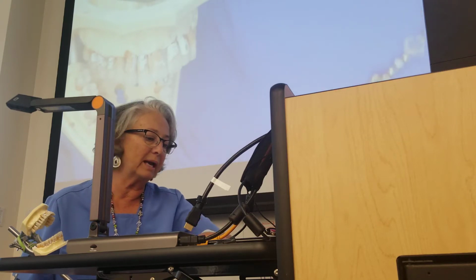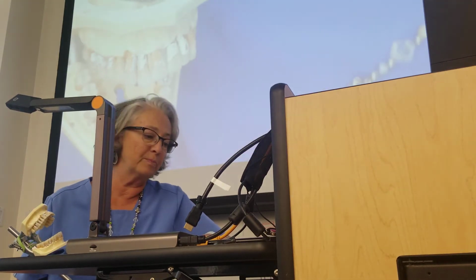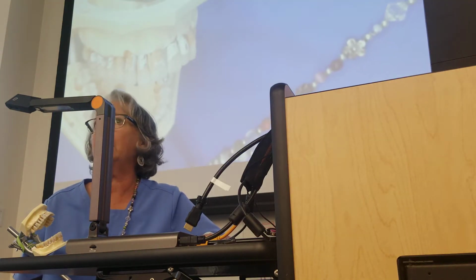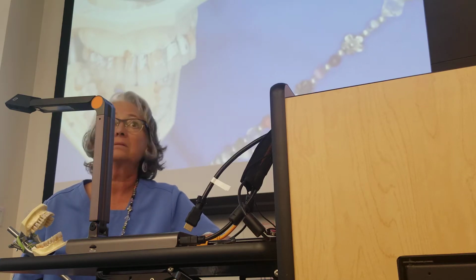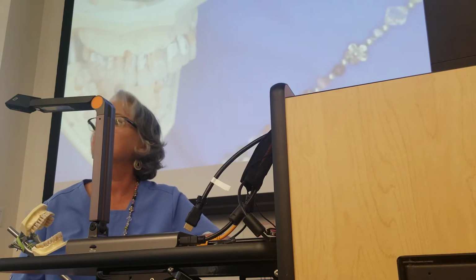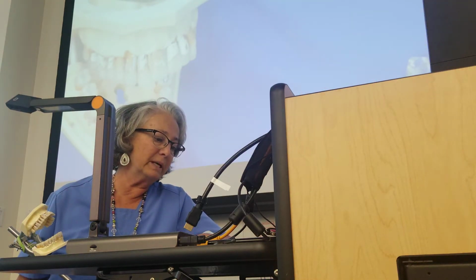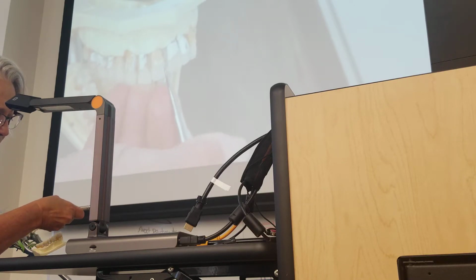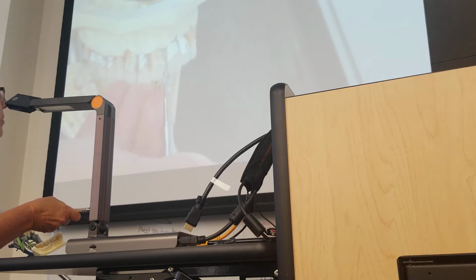Okay? So like this. Insert the working end to the base of the pocket. Adapt the toe third, remember the toe third, to the root surface. Imagine locking the toe third against the root surface. Locking it means make sure that it's stable so that you're not going to cause trauma. Instrument from the midline of the facial surface toward the mesial surface. Okay, so here we are. All the way up to the incisal edge.